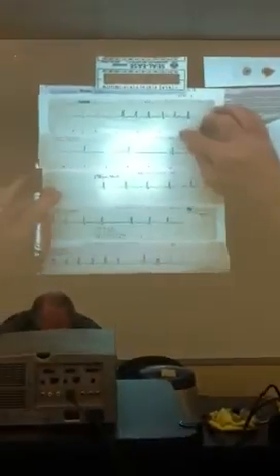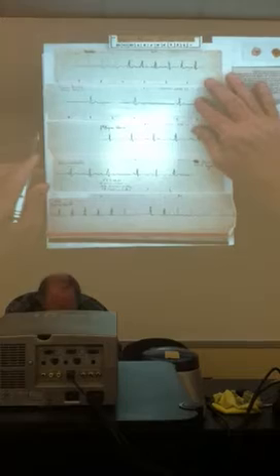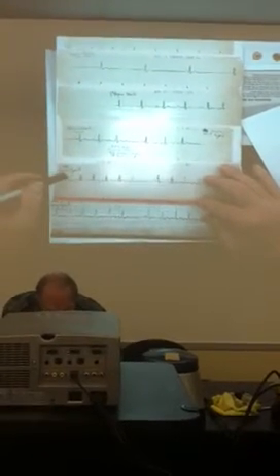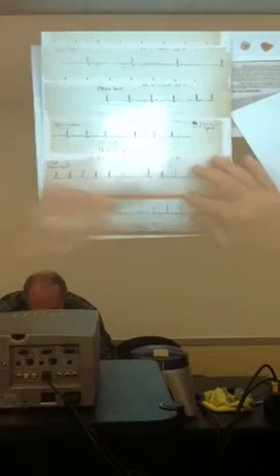All right, the others down here, I don't know if I have them marked off real good. This one down here, the one I showed you a while ago, the one at the bottom, second degree type 2, all right? This guy, look, 1, 2, 3, 4, 5, 6.